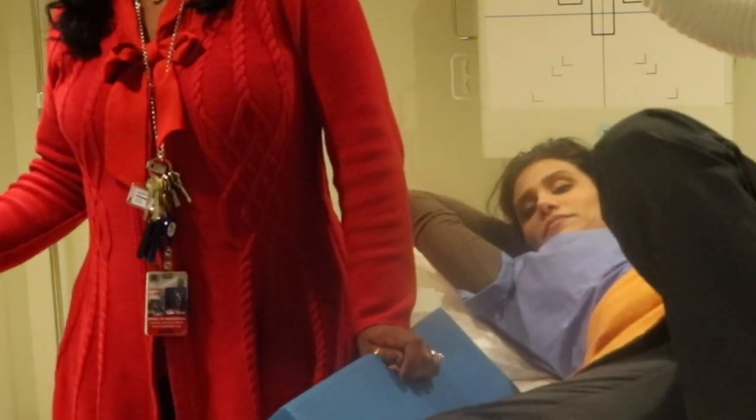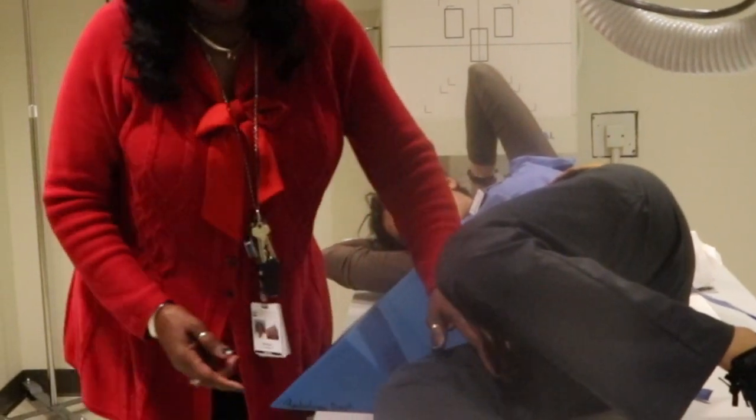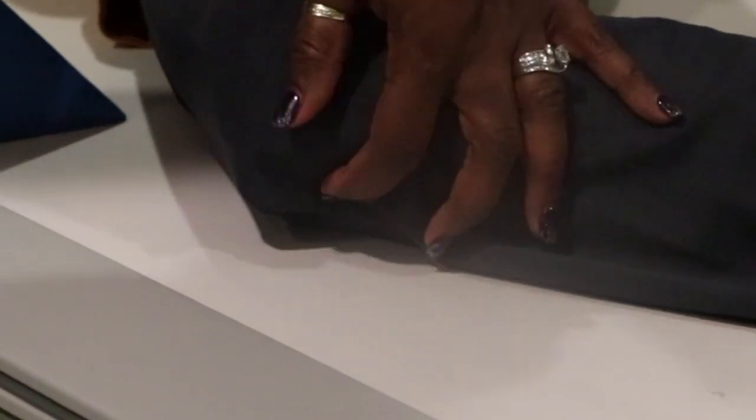Now what we're going to have her do is rotate toward the lateral side of the affected side. Let's roll all the way up onto your hip. And we did state that we would have to flex the knee. Now it's very important to feel for the patella. Here's her patella here. Does the patella look like it's perpendicular to the image receptor or the tabletop? No, it's not. So what we want is perpendicular.